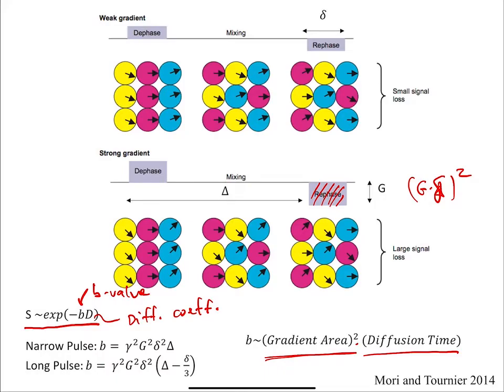The other thing I can play with is the distance, the delta between the gradients. Because if I apply gradients here and then I wait a long time before I rephase them, they have all this time to get out of sync. Okay, so those are the two factors.